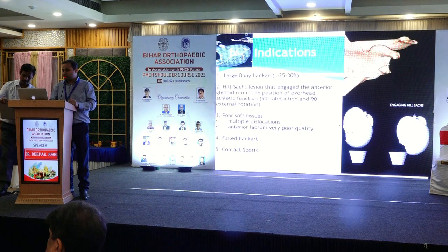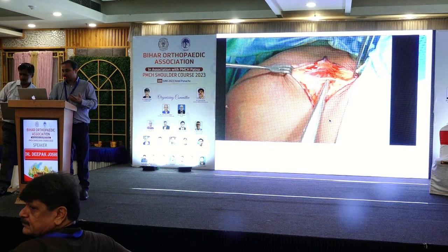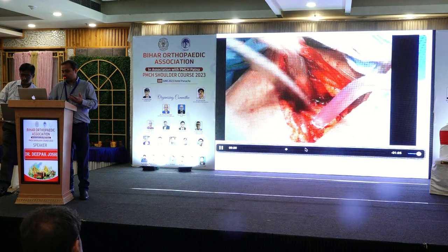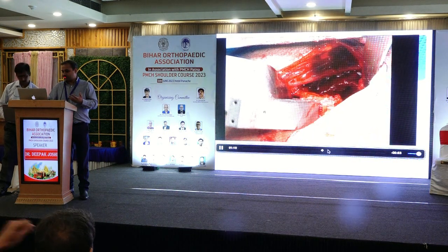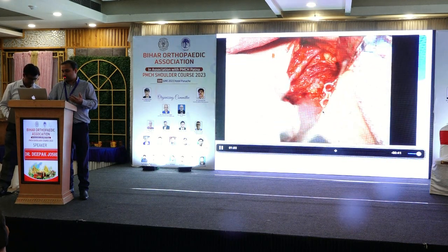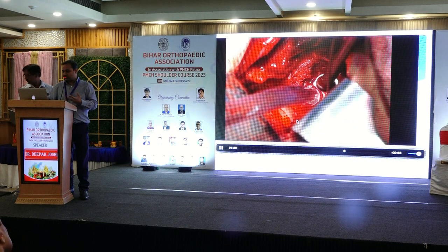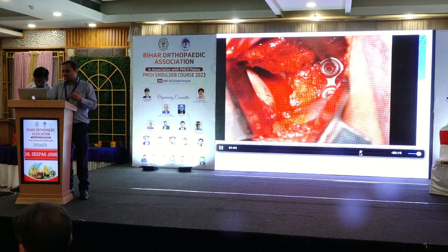It's only that we all know that we have to transfer the coracoid to the anterior glenoid. So this is how it's done. You can see the coracoid is taken, and we just osteotomize the coracoid. We measure it. We go between the subscap. The most important thing is that it has to be flush with the glenoid. So that's the glenoid, and there's a plate and the 2 screws being put. You can see there's a glenoid inside, and the subscap is split, and we just put it at the face of the glenoid, and it is neither overhanging nor going behind.